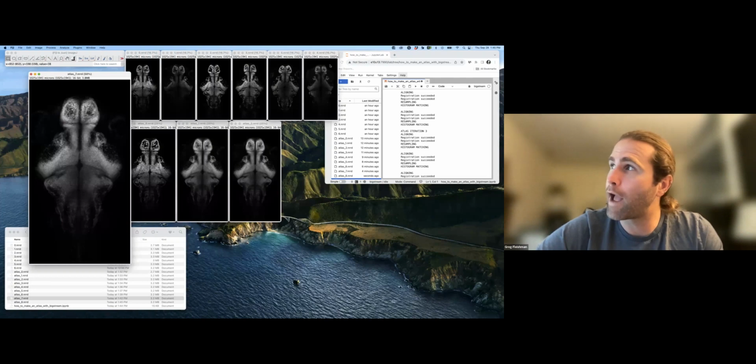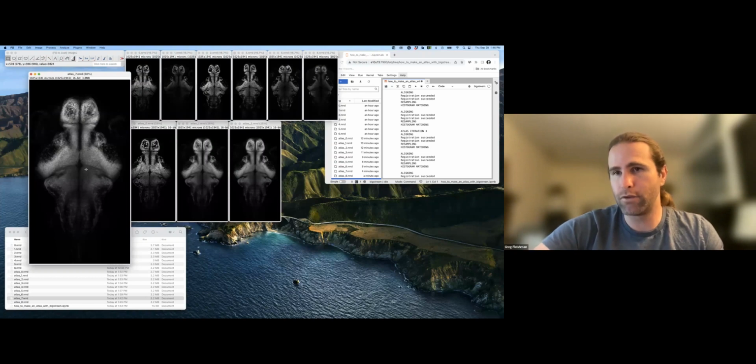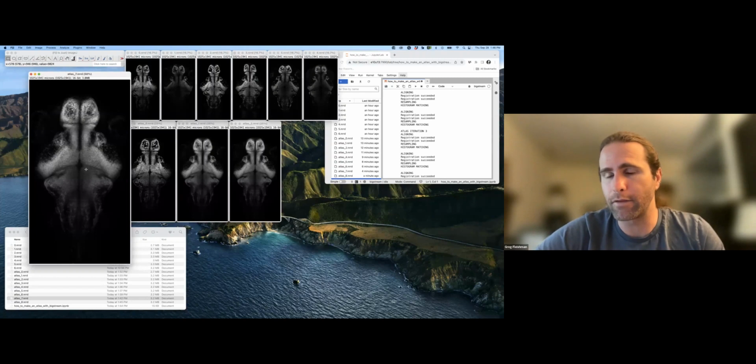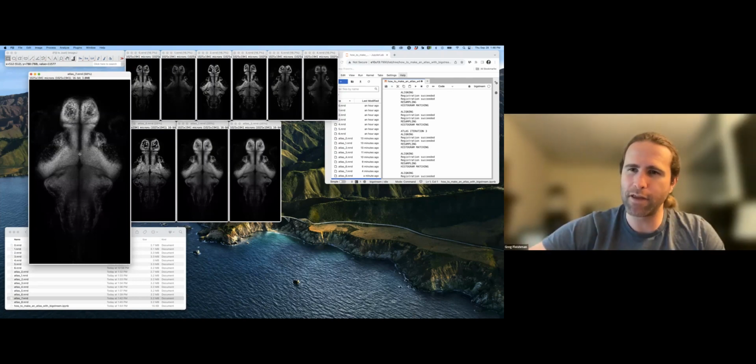Another thing to do after averaging the data from all your subjects might be to take this Atlas image and register it to a public Atlas. Then you only have to do one registration, your study-specific template, register that to the public Atlas, and now all of your subjects are registered to the public Atlas by chaining together the transforms from your study-specific template to the Atlas and all of the alignments that you have of your individual subjects to your study-specific template.